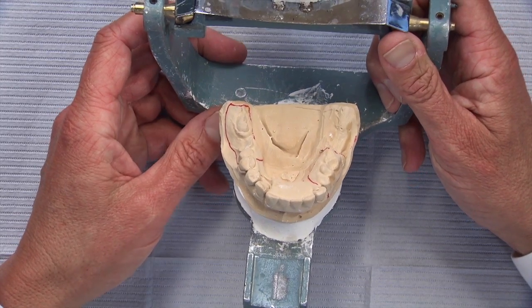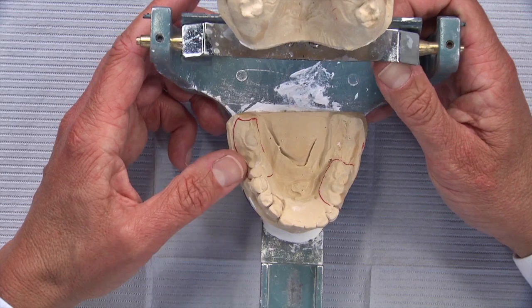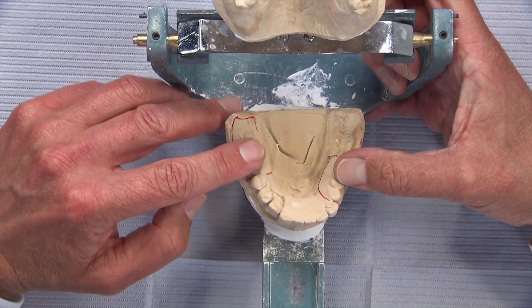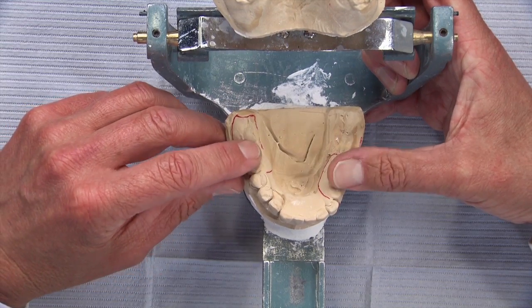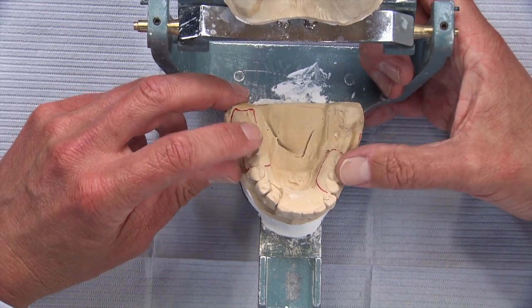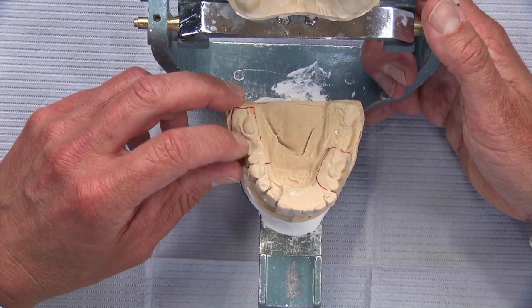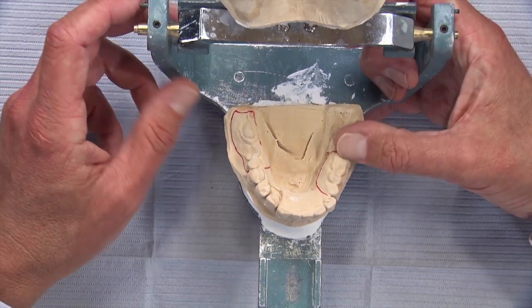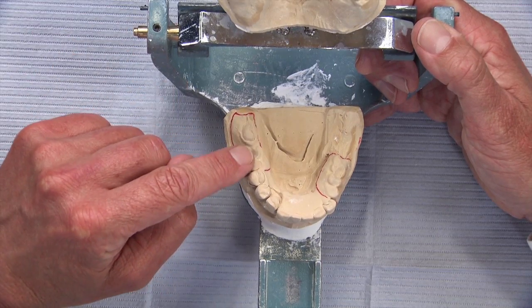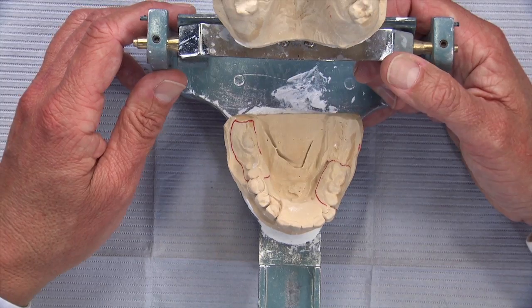Or the last thing is the doctor could, and this might be the most affordable just in terms of the lowest lab bill, build these teeth and a little bit over here back up again with tooth-colored acrylic perhaps, or composite. Composite doesn't necessarily stick at all to denture teeth, but with enough potholes in here, if he wanted to use composite, he might be able to do it, or use some acrylic as well. So the doctor liked the idea of building it up with acrylic, almost a block as much as the teeth, just to be able to open it up.